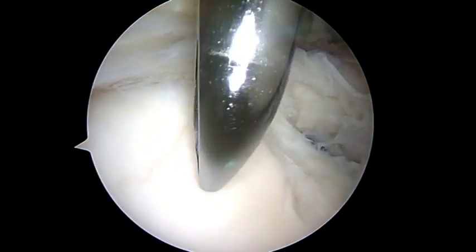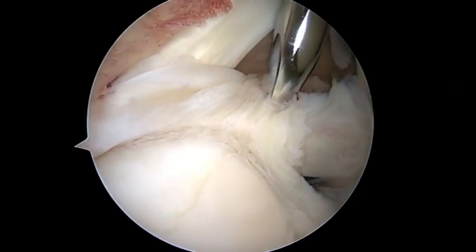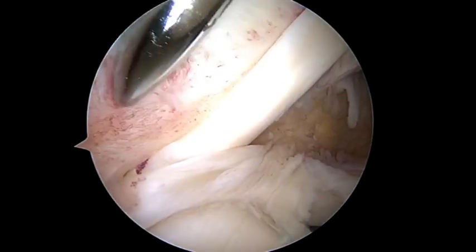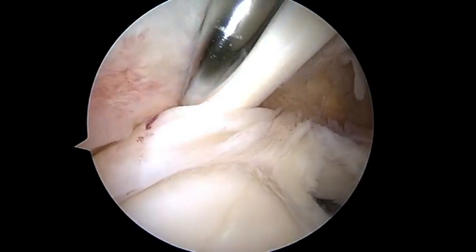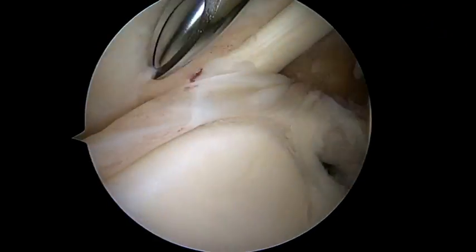I'm Jim Bradley. I'm going to talk about the Torpedo Resector. It's brand new from Arthrex. It's conically shaped and very good for multiple purposes, such as a synovectomy here, which I'm showing you in this right shoulder with a rotator cuff tear.